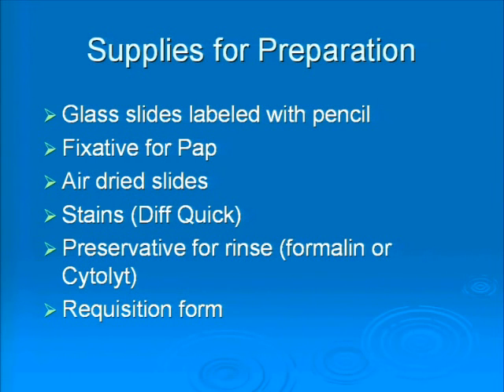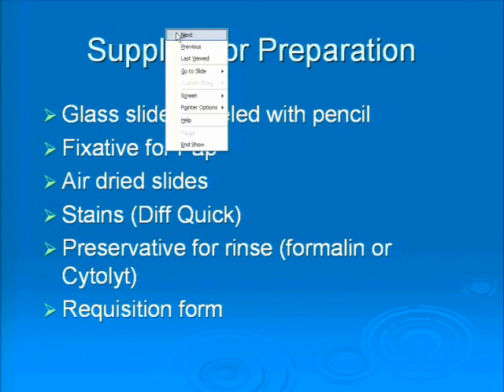We're trying to train cytopathologists with the same lingo that you're learning and using for ultrasound, okay? So the more information you can give them that the nodule is hypoechoic or hypervascular or circumscribed or irregular margins, the more specifically they can help you with what your diagnosis is, okay? In the new Bethesda terminology, there is the option that your cytopathologist can tell you, if you give them all cyst fluid, instead of calling it unsatisfactory, that it's consistent with a cyst, but you have to give them that history, that by ultrasound it's consistent with that, or you're not going to get that. You're going to get unsatisfactory, because they cannot tell you that without knowing that's what you are already thinking, so that the two go together, okay? So the requisition form is actually very important.